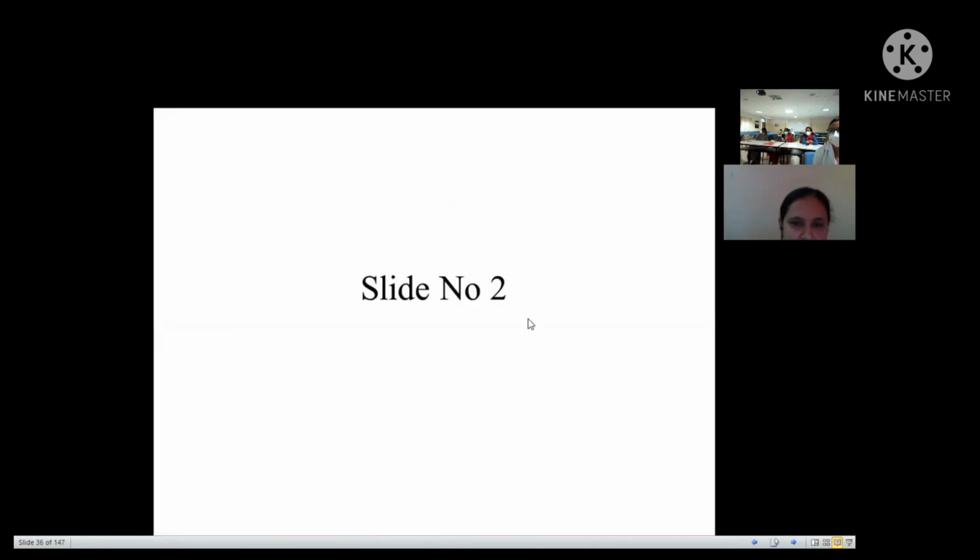Shall we move on to our next slide? Yeah, one question. Where else can we see shadow cells? If I just say hematology, this is for our PGs to answer. Shadow cells, ghost cells in hematology. Yeah, continue.